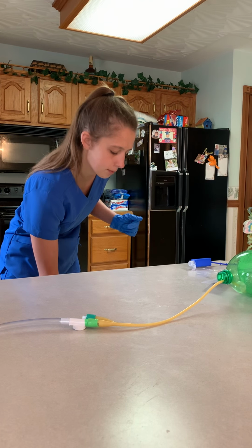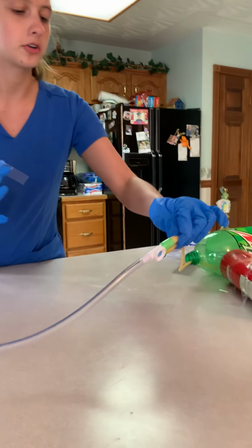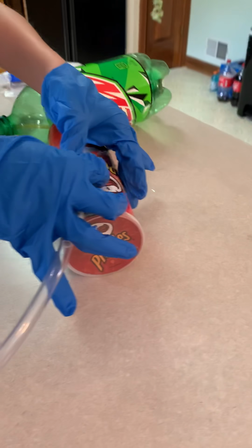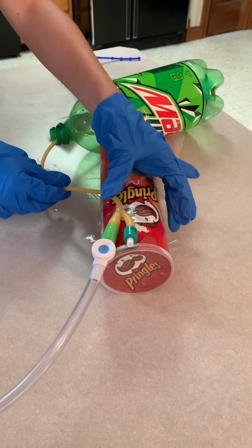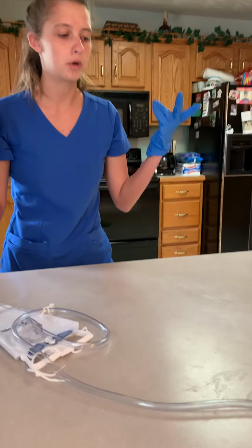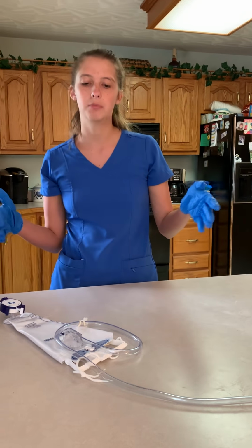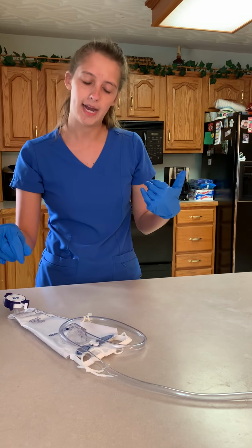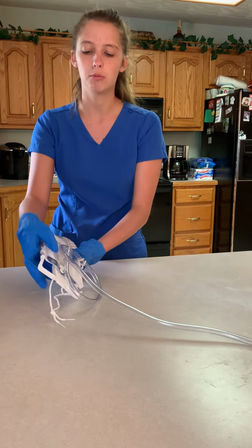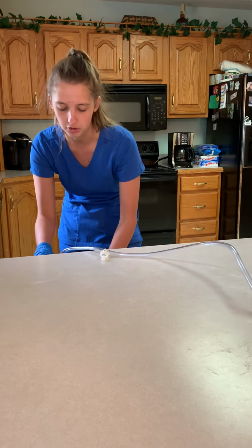And when we tape, we're going to make sure that there's no strain in the catheter tube. So we're going to hook right here, and then we are going to tape. And we just want to make sure that it's not too tight, it's not pulling, and that there's no strain. And so now what I would do, if we actually had a real hospital bed, is attach this bag to a non-movable part of the bed. And when doing so, I will make sure to keep it below the patient's bladder at all times so we don't have any backflow.